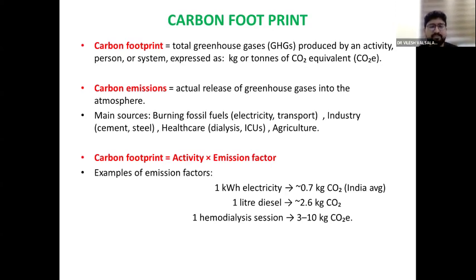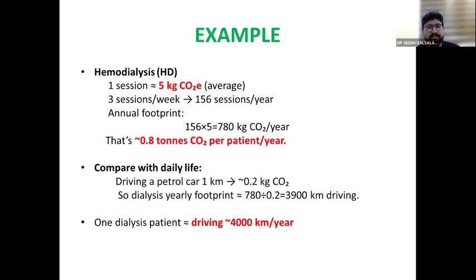To understand this, some few examples from daily life. 1 kilowatt-hour of electricity is around 0.7 kg of carbon dioxide in India. When you burn 1 liter of diesel, it is around 2.6 kgs of carbon dioxide. And just one hemodialysis session produces 3 to 10 kg of carbon dioxide emission. If I had to give it in the form of an example of the patient we mentioned, one session is 5 kg carbon dioxide.